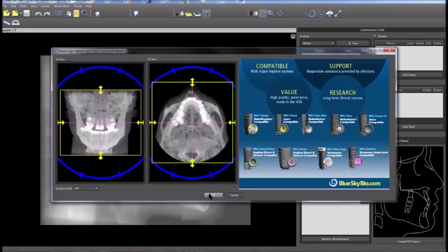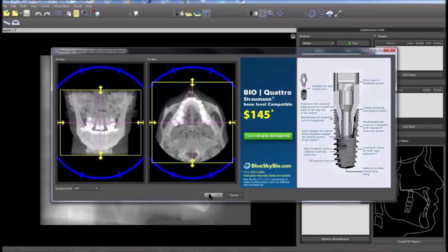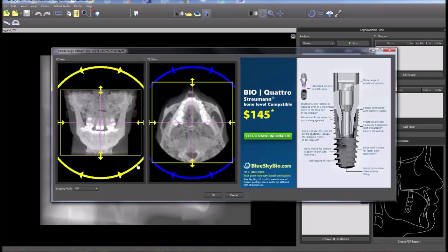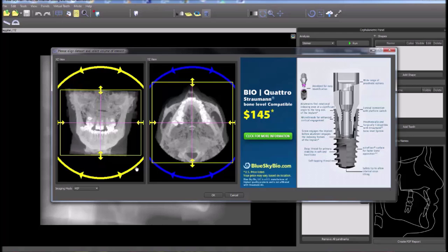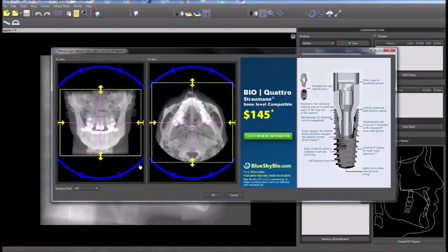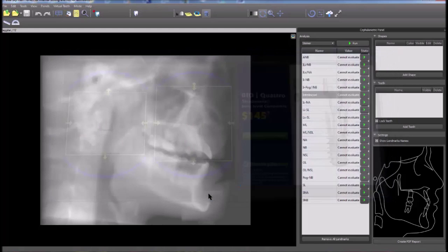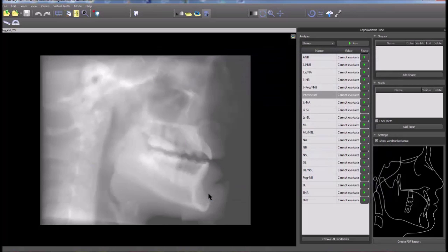In the Align Dataset window, rotate the views using the surrounding circular widgets if necessary in order to ensure that the scan is completely straight. Click OK to load the image.